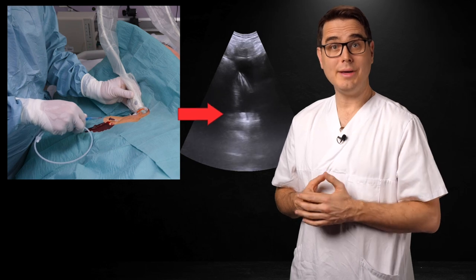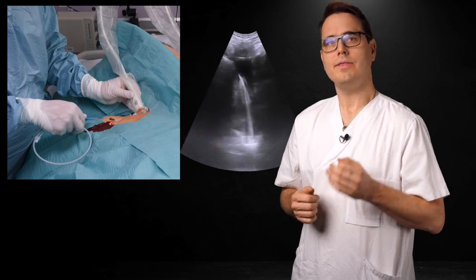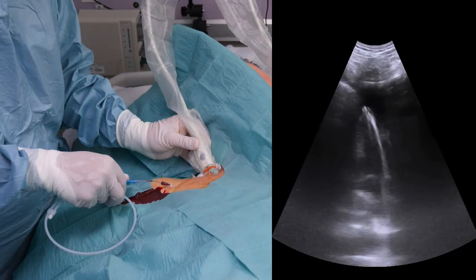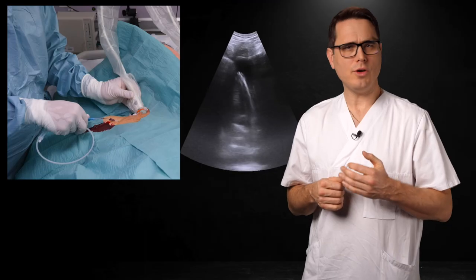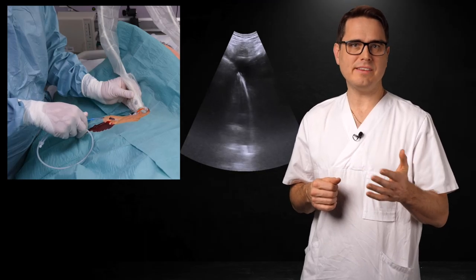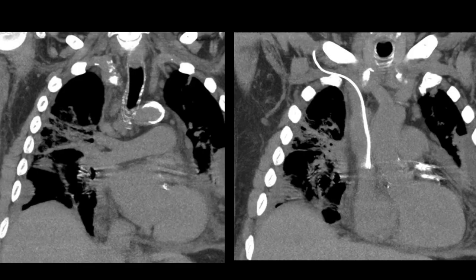In this video, you can even see the J-tip clearly and trace it as we feed the guide wire. The J-tip should ideally be placed at the level where the right pulmonary artery crosses the superior vena cava. Don't go any further, as arrhythmias can be provoked if the wire enters the heart. We can illustrate this point with a CT scan: the right pulmonary artery can be seen in the left image, and in the image on the right, the catheter tip is seen just at the cavoatrial junction, corresponding to the lower border of the RPA.